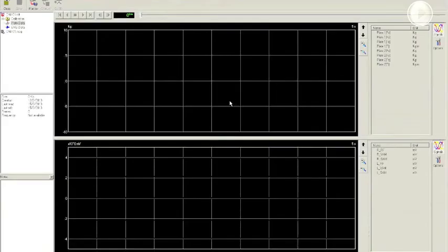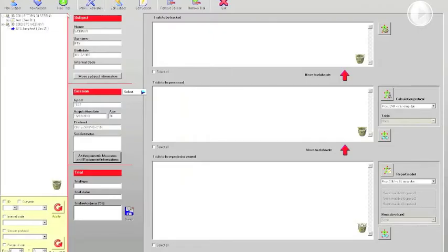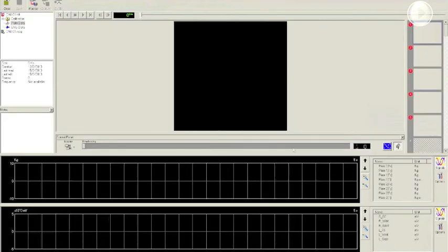Okay. Let me show you also the cameras. And just to be sure, okay, let me do it. Okay, new trial, counter movement jump. Just to be sure that all the system is checked and correctly working. In this case, in which we do not use the cameras, of course, the calibration will not be depending on the cameras. So here we will see the video recording, the force platforms, and every muscle that we want. In the meanwhile, my FREEEMG 100RT is already all configured with the muscles that I'm going to use. I just need to click on monitor.